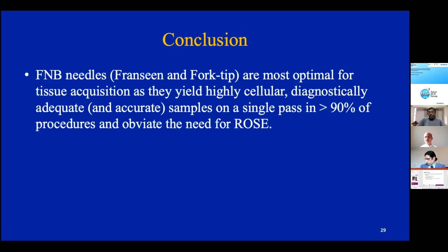biopsies. But if you don't have a 22 gauge FNB needle and FNA is all that you have, and your pathologist is asking you to get your core tissue, then I think it is reasonable to use a 19 gauge FNA. If not, I will not use it.